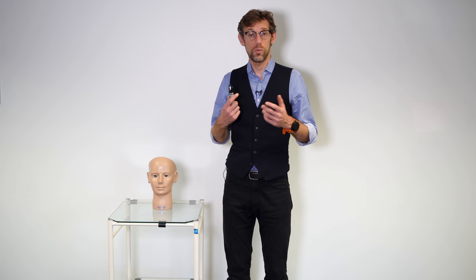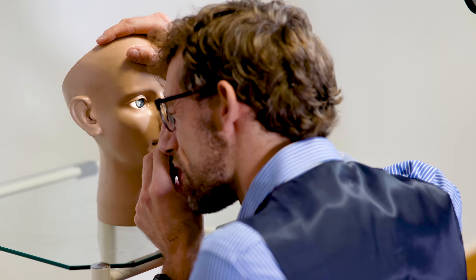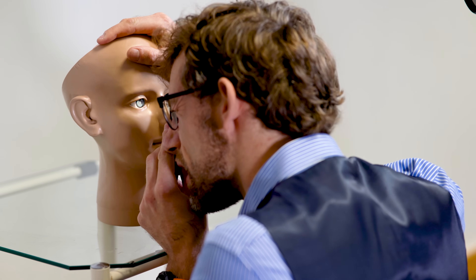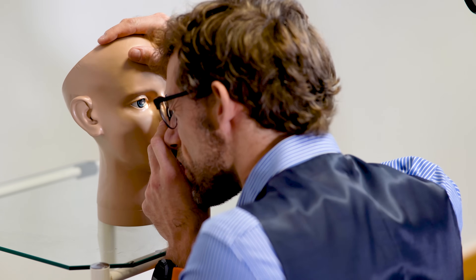Having looked at the red reflex, with our magnifying setting we move close to the patient and place our hand on their forehead to make sure we don't accidentally bang into them. As we do that we look at the anterior of the eye. Going in with the right eye to their right eye, I ask the patient to look at something in the top left of the room. I'm having a look at the eyelids, checking the eyelashes, looking over the pupil and iris, making sure there are no problems with the cornea, and looking at the conjunctiva. From there we turn the dial again to bring the back of the eye — the fundus — into focus.